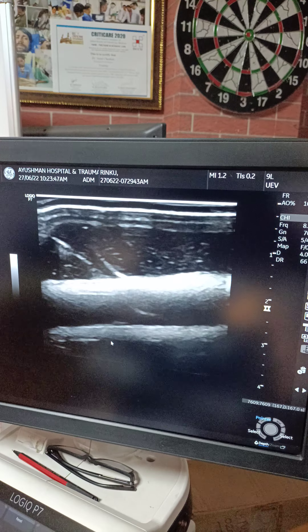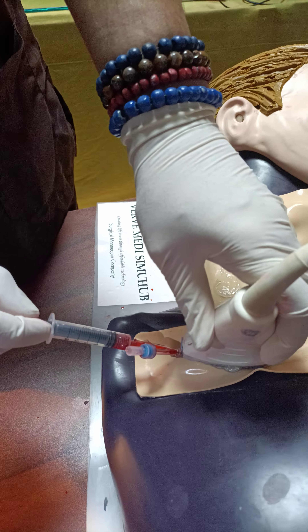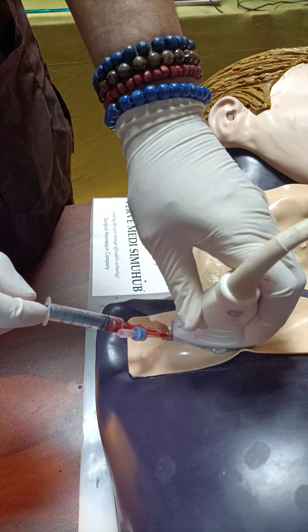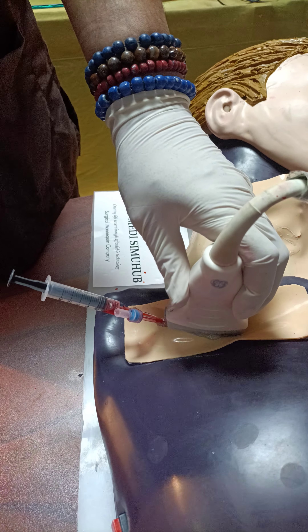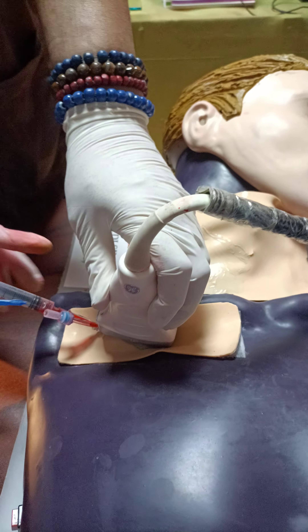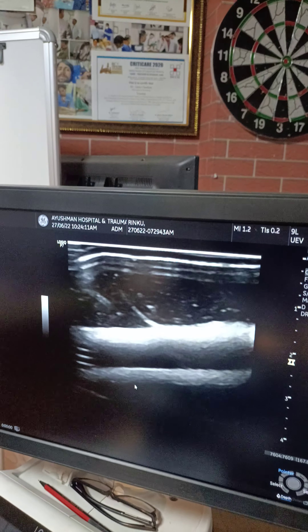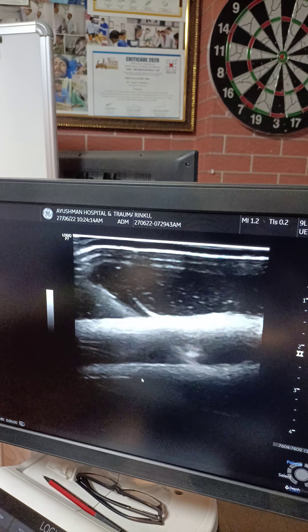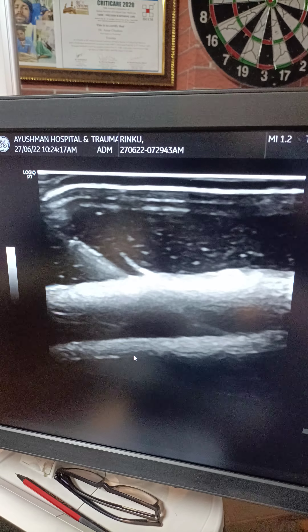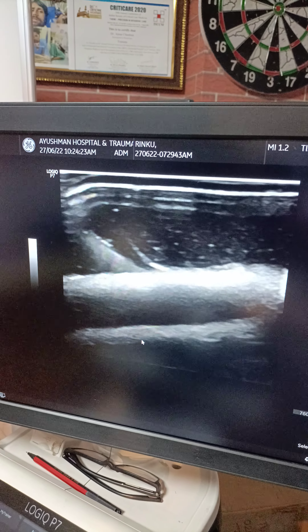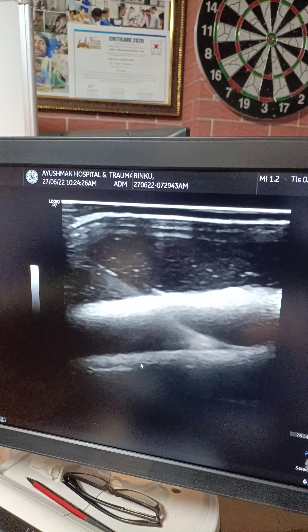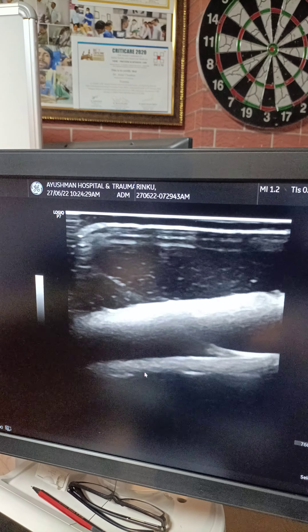Sometimes you may be posterior to the vessel and think you are inside — as they say, the proof of the pudding is in the eating — so you must withdraw blood. Now you can pass the guide wire. You can see the guide wire going into the lumen. You can learn ultrasound guided vessel access and central line placement on this mannequin.